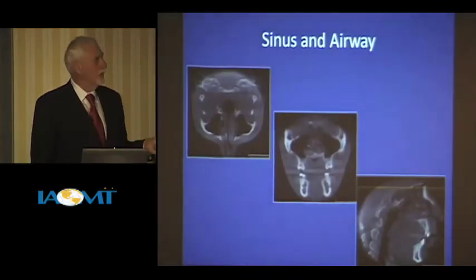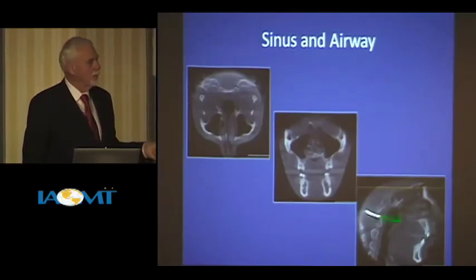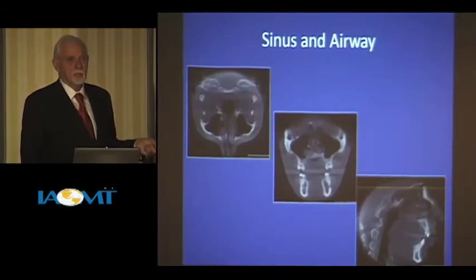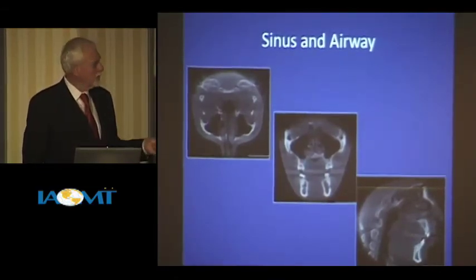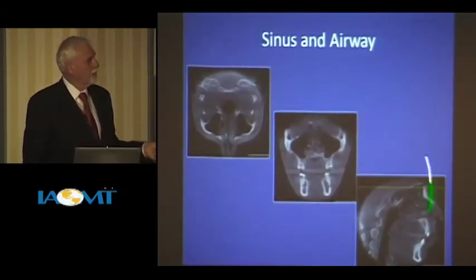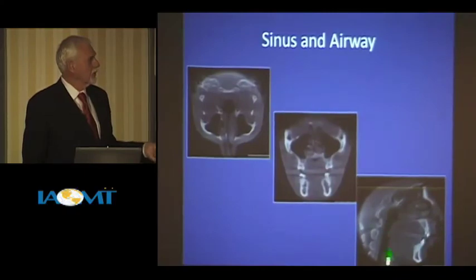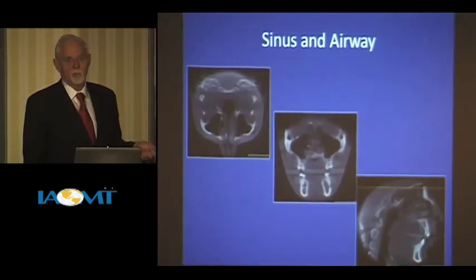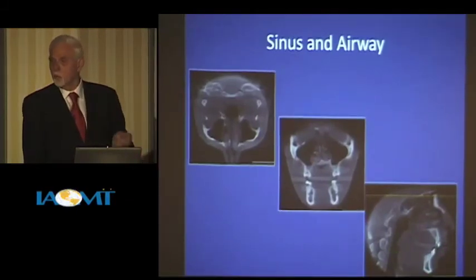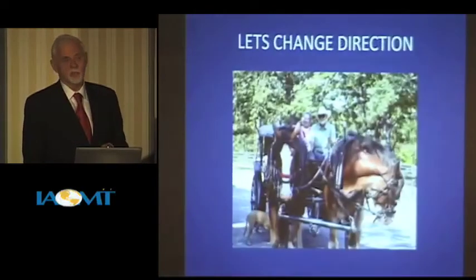All right, sinus and airway. Look at this, okay? I think we'll be able to do it when I pull up the other one. I got real involved in sleep apnea and airway disturbances a long time ago, and haven't done that in a while. So this is an area in my practice that's really underdeveloped, but it has the potential for you to look at the airway. If you haven't put their front teeth together and you get your CAT scan and the airway's open, what is that? It can tell you a lot of things. One thing it can tell you is that maybe with an intraoral device you could open their airway.